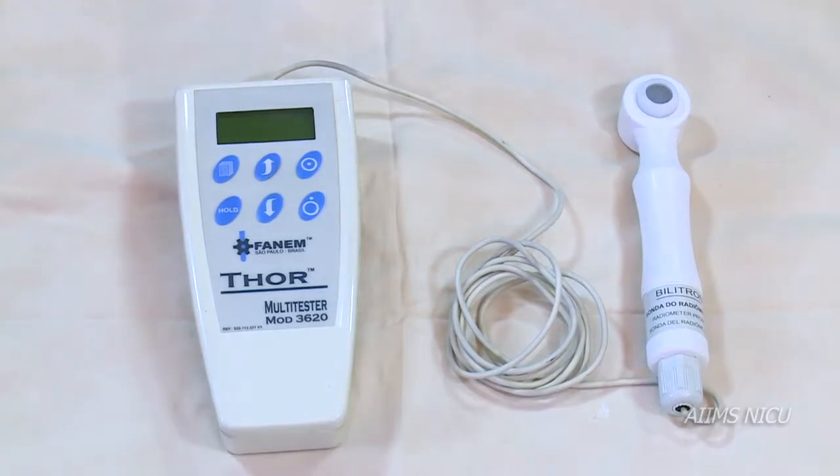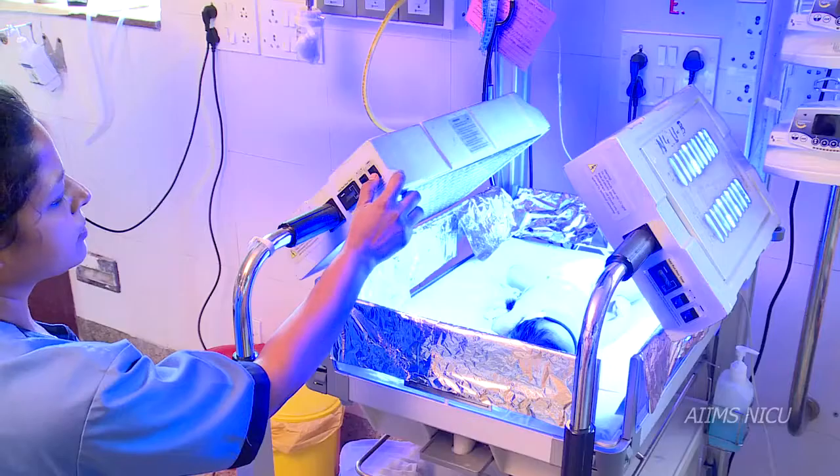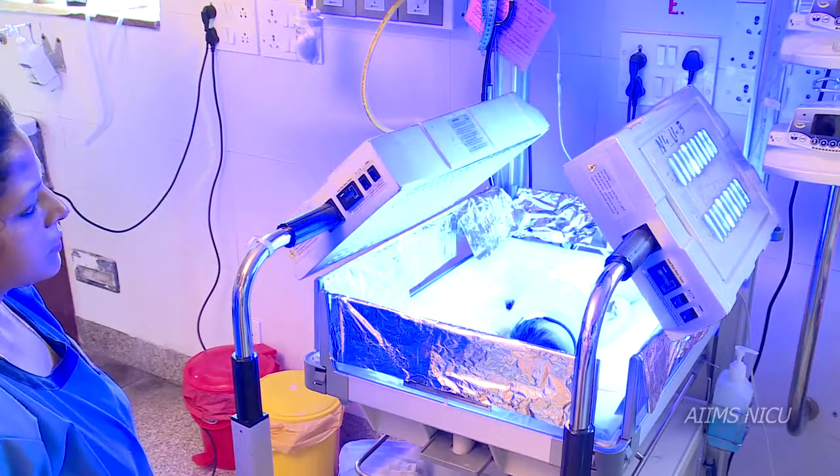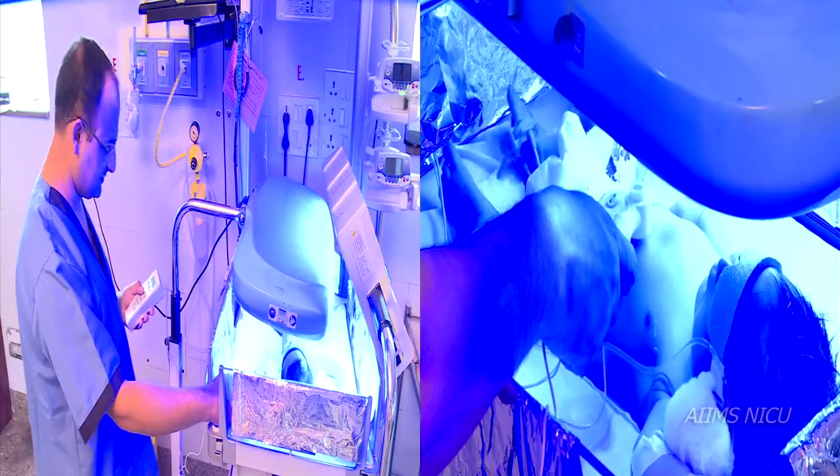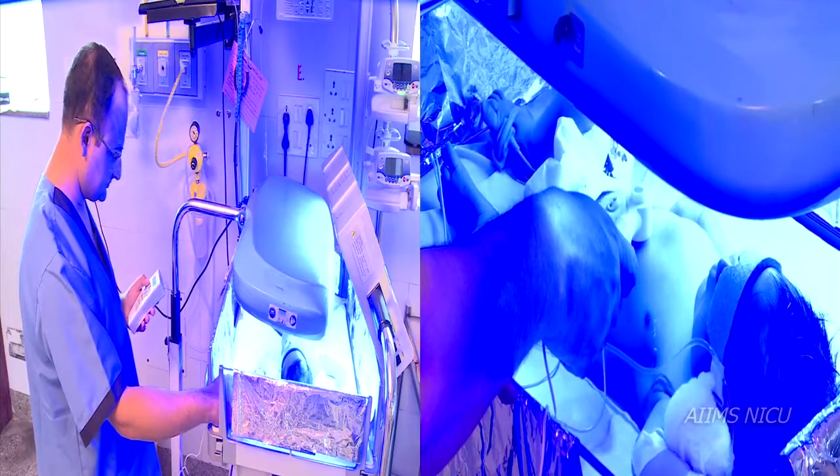Calibration of flux meters is complicated and best performed by the manufacturer. It is important to perform periodic checks of phototherapy units to make sure that an adequate irradiance is being delivered.